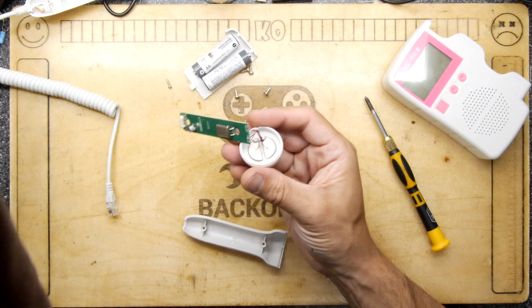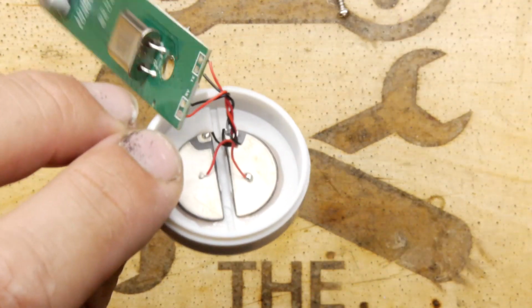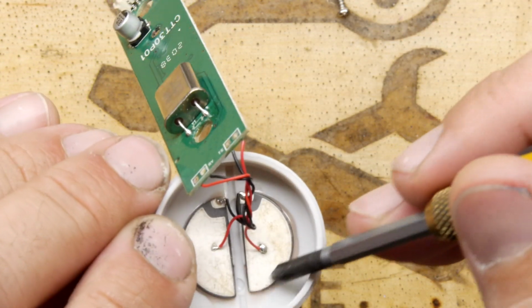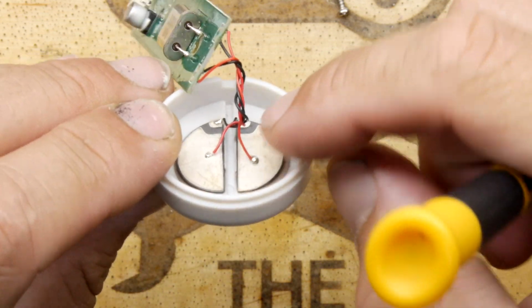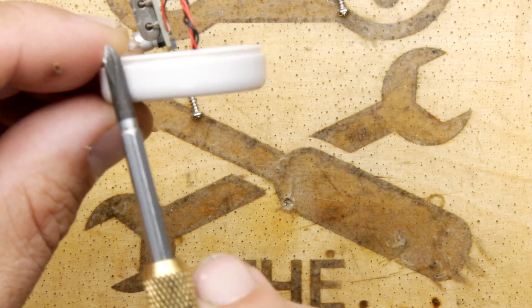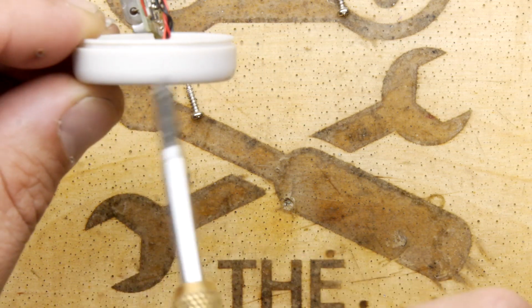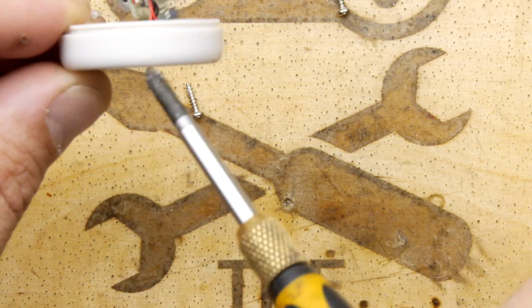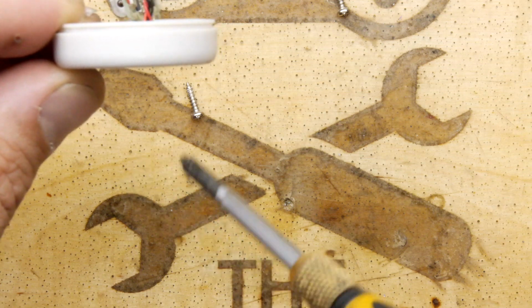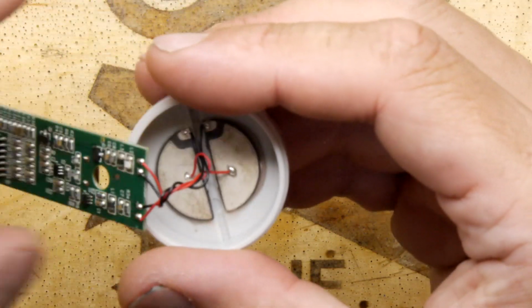But what's interesting about this is that actually you have 2 pieces of piezo in here, but it's hard to tell on the camera. They're ever so slightly angled. So this one is sitting flat to this face, but this one is actually aimed, so it's tilted. So it's going to be coming at an angle. So one's going to be transmitting, and then it's going to hit your heart, your moving object, and that will be being received by the receiver on that side.